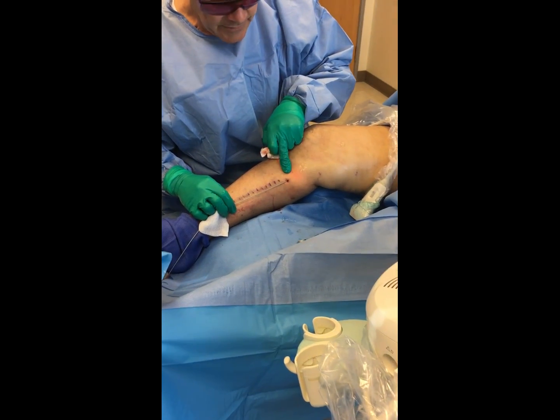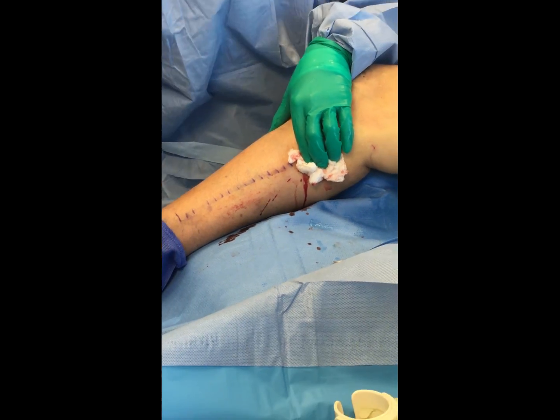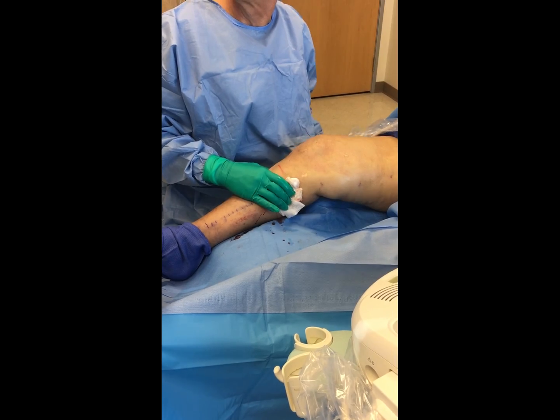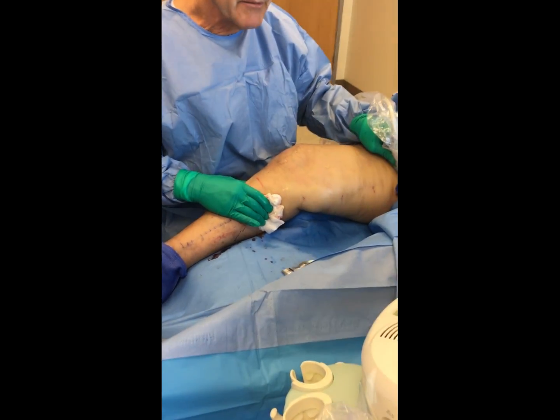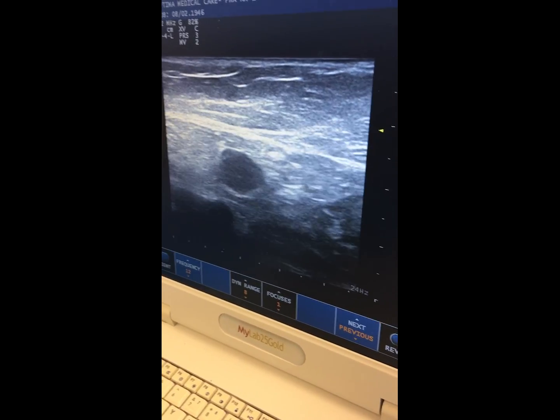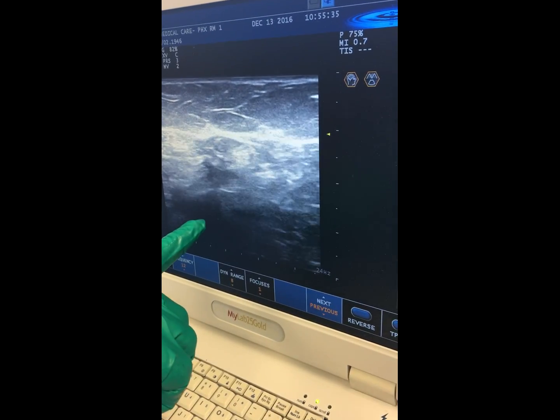What you're going to see here is the laser fiber come out and a little bit of blood because we didn't close it all the way down to the bottom. So that's the laser procedure — we started at 31 and it's 51, so we took about 20 minutes. I'm going to take a picture of the proximal segment of the vein. What you'll see on the screen — let's put a little pressure there.